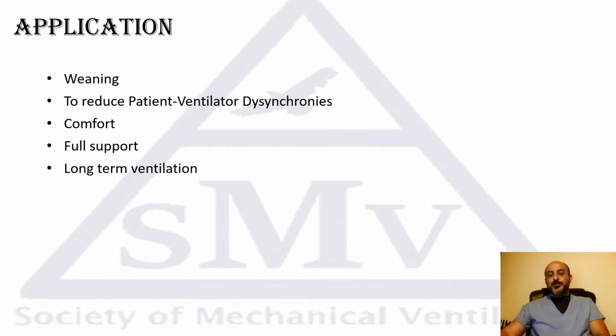So why would people use IMV or SIMV, and when? Originally, the studies looked more at weaning patients from mechanical ventilation. The idea was to start some controlled mandatory ventilation, then slowly, gradually decrease the mandatory breaths, and basically shift the load from the ventilator to the patient. But in the late 90s, as we'll talk about later, most of the studies showed that it might actually delay weaning.